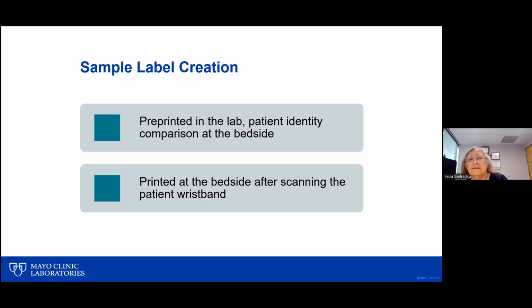So you can't underestimate how people will work with the systems that you have, because again, everyone is trying to do the right thing, but they're also trying to be as efficient as possible. If they don't recognize the risks, or if they're in a hurry, you can see shortcuts being made that will be problematic. So I have been an advocate of printing labels at the bedside for at least a couple of decades. It's not necessarily an easy thing to do, but we have at Mayo developed a way to do that, and that's what I'm going to show you. Then I'll show you the results in terms of sample errors.